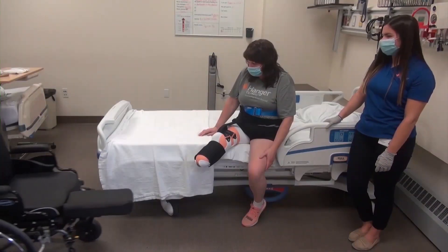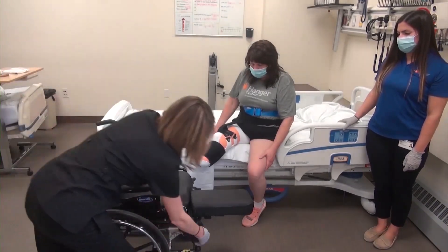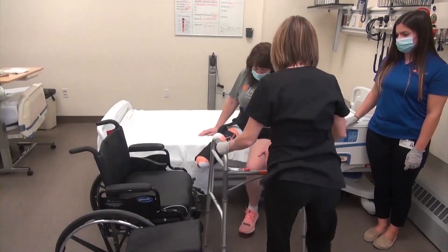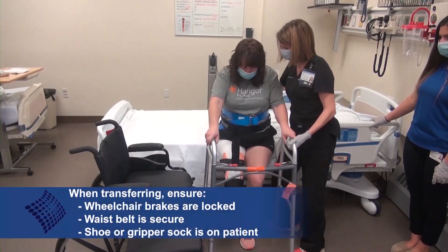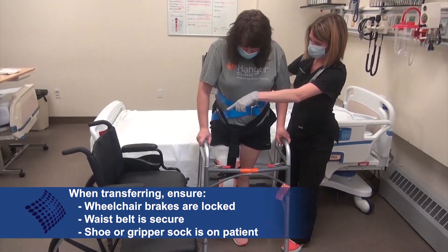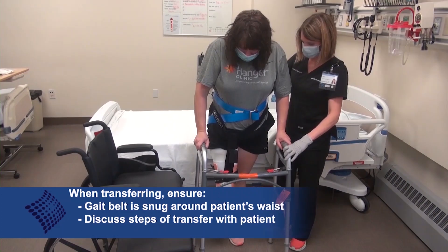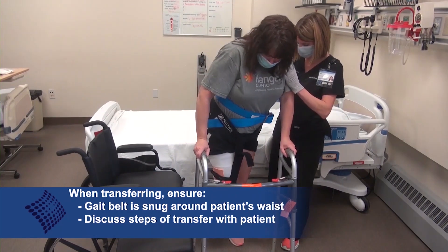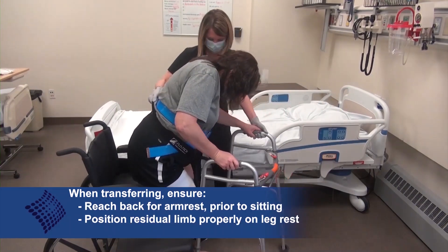An issue you may experience with the transtibial rigid removable dressing is migration off of the patient's leg when they are transferring or moving with therapy. This can be a safety hazard, as the device is more likely to fall off and injury could occur. To mitigate this issue, ensure that the waist belt is being used and that it is secure and threaded through the proximal straps on the device. Another fix may be to add a thicker sock if the device is loose — a three-ply or five-ply can substitute the one-ply, or a combination can be used to fill the space between the shrinker and the rigid removable dressing.